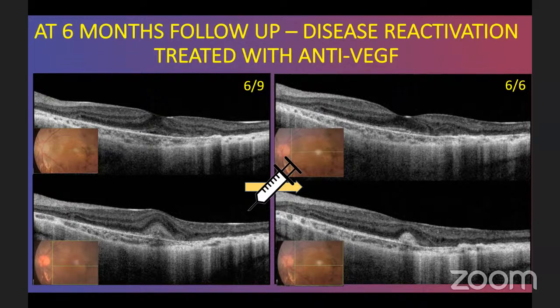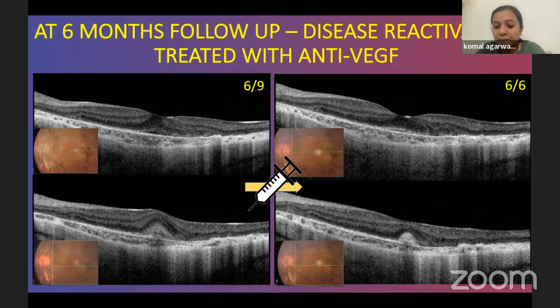So again, we lose that advantage, because even in the case which Dr. Shishir had presented, it was predominantly subretinal fluid. You hardly saw any intraretinal fluid, despite such a long follow-up. So I don't think it's going to help. It is a very tricky thing to have, and unless you have some stark sign, it's always going to be a challenge. Dr. Sharath, your views on that?